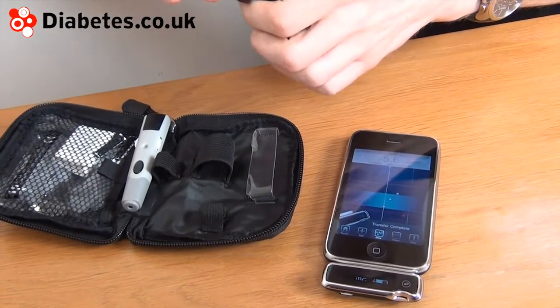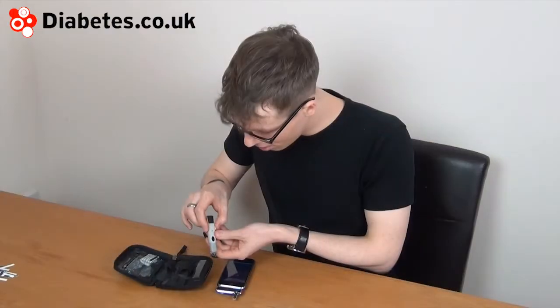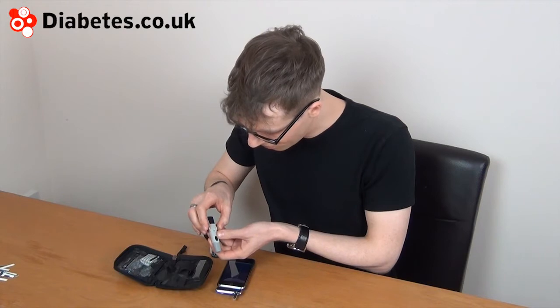The blood glucose test strips only require a small amount of blood. The finger pricking has a variable test setting depending on how thick your fingers are.